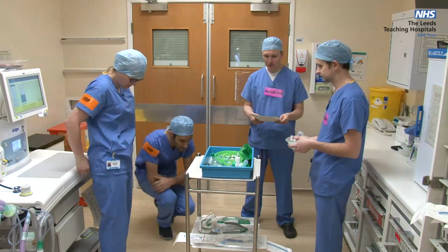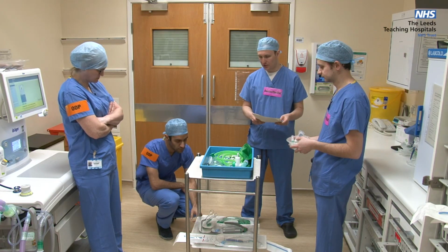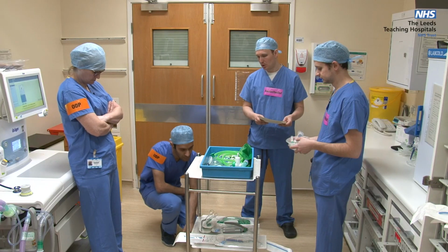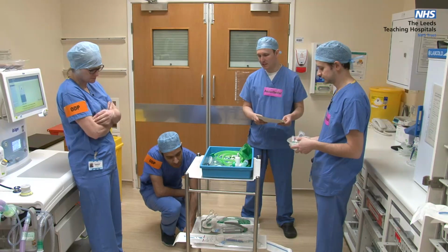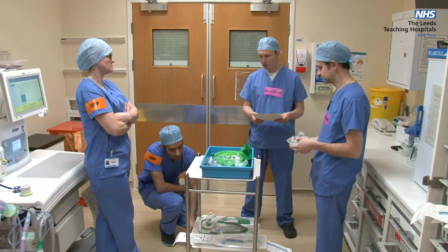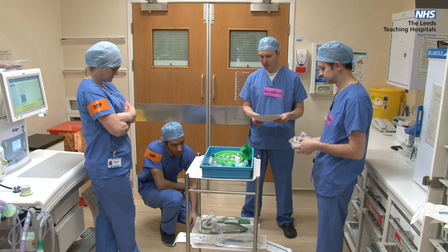And Harshal, we're just going to run through the equipment for outside the room. So we have an alternative laryngoscope. Yep. iGel size 4. Yep. Front of neck access kit to include a size 10 scalpel. Yep. A size 6 ET tube. Yep. And a bougie. Yep. We've got a spare endotracheal tube. Yep. We've got nasopharyngeal airways. Yep. And we've got McGill's forceps.